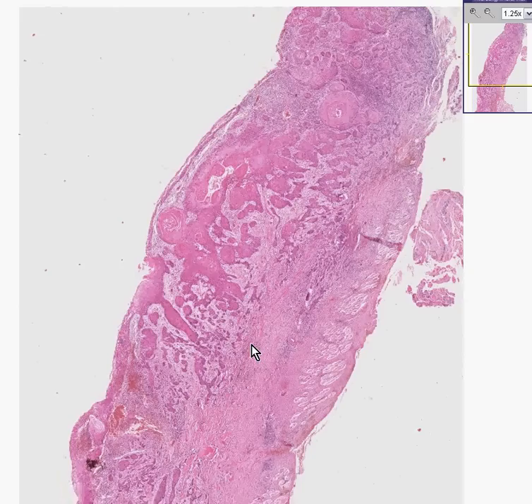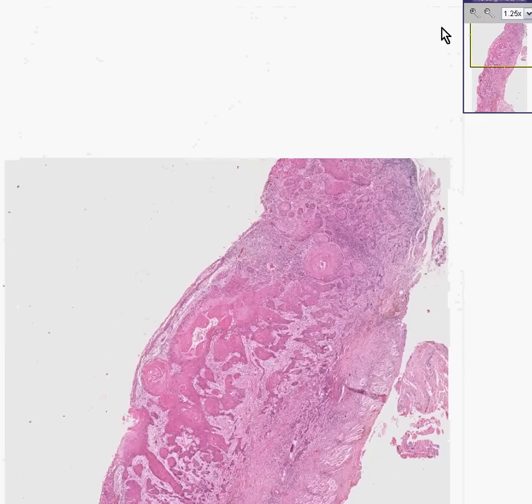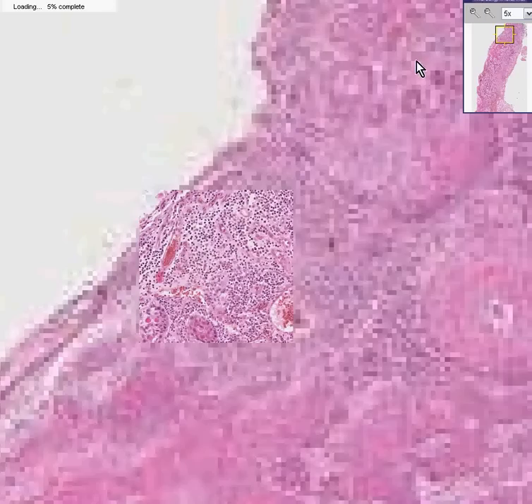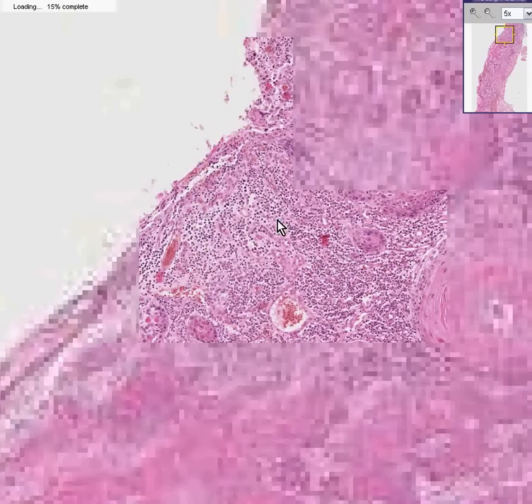Here is a part of the mucosa that is perhaps ulcerated, thickened, and solid tumor. But in this area here, you have a little rim of overlying normal mucosa, and I think you might be able to recognize this area as perhaps having a lot of secondary inflammation as well. This is primarily a chronic and organizing inflammation.